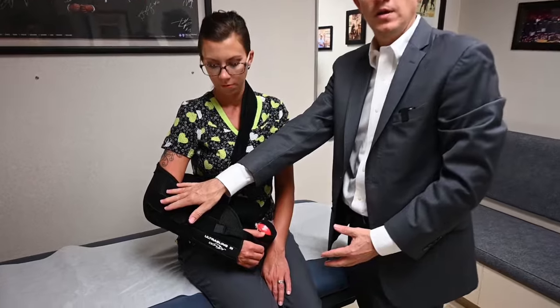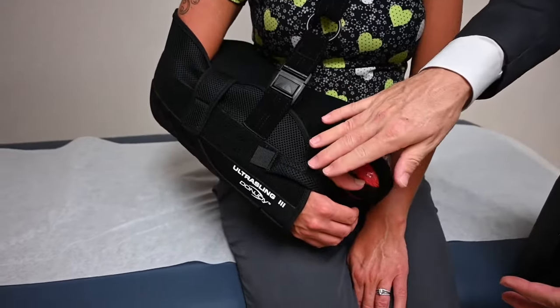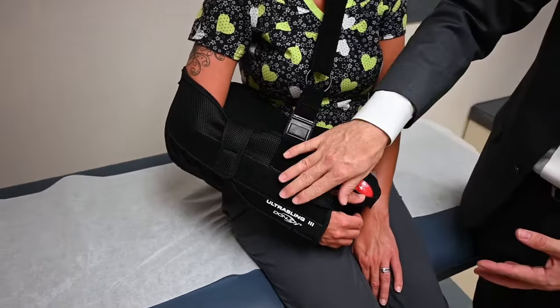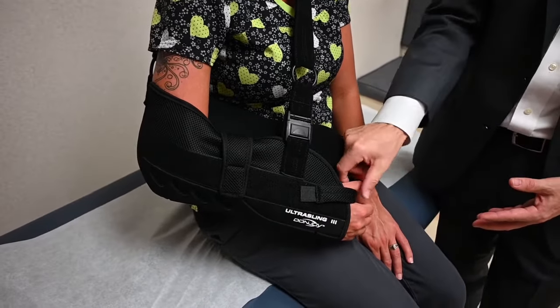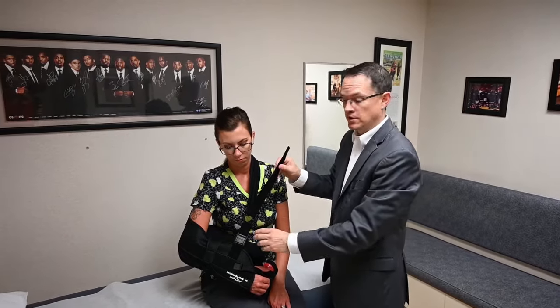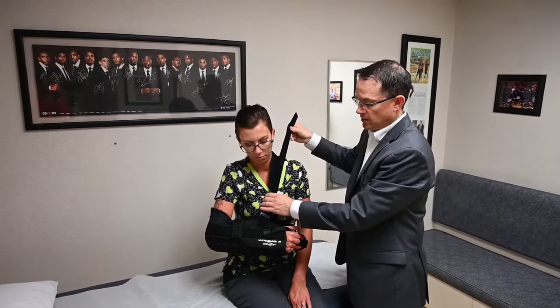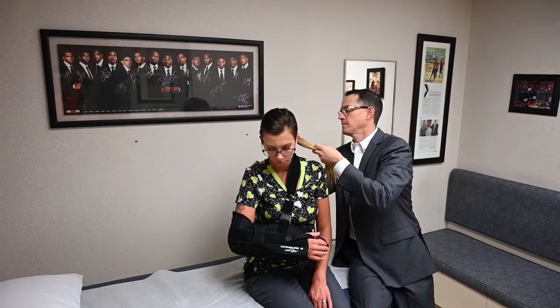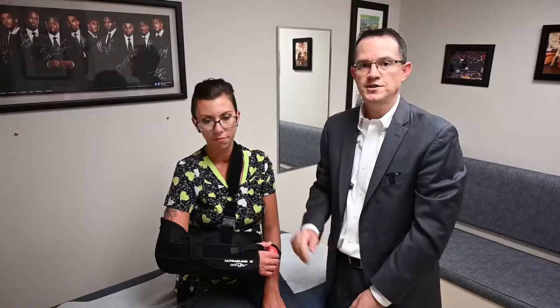The first thing to know about this shoulder immobilizer is the position of the hand relative to the elbow. All too often patients come in after surgery with the hand positioned well below the elbow. When that happens it causes the arm to want to slide out of the front of the sling and places a lot of pressure on the thumb. To adjust the height of the hand, simply adjust the strap that comes up and over the neck. By pulling up on the strap you can reposition the hand so that it is even or level with the elbow, which is a much more supportive and comfortable position.